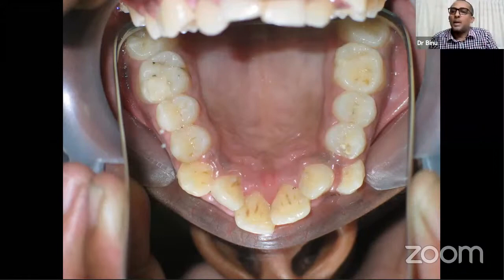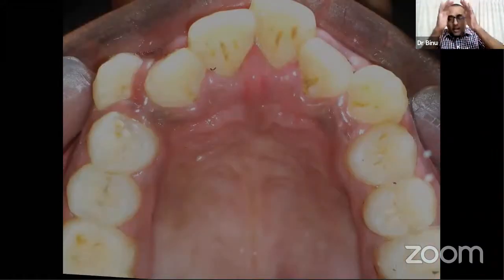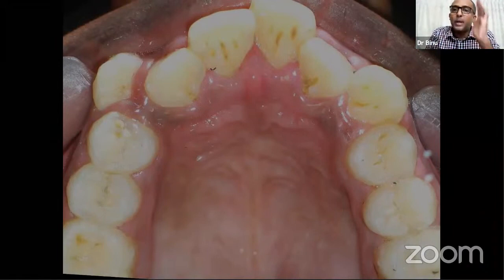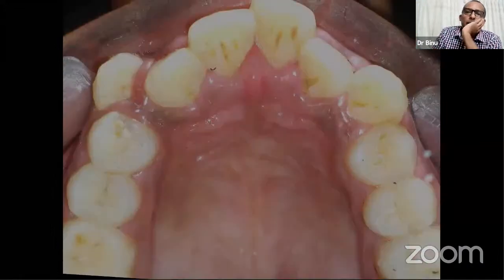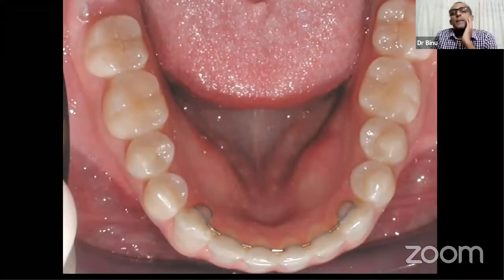That's not professional. Don't be surprised if parents ask you one day on face, Doctor, why are you taking my daughter's picture with mobile camera? What answer can you give? So take consents. Take consents. Talk to them. Explain to them the importance of photograph, and then do. If they don't allow, that's not your patient. Take a picture like this and then crop it, turn it, rotate it, make it upper, make it lower separately, and then only show it to the patient. That's a lower. Upper, lower. Picture taken and cropped and shown to the patient.